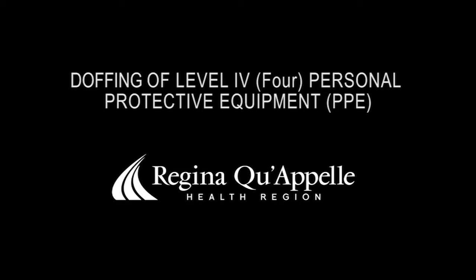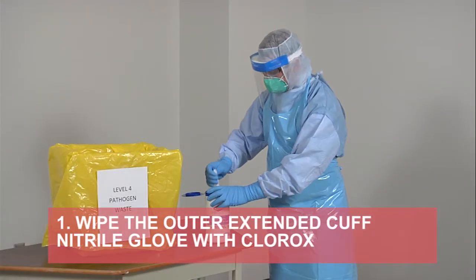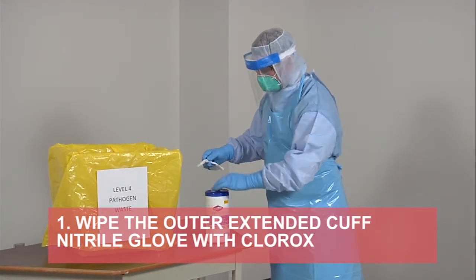The purpose of this video is to demonstrate the proper way of doffing Level 4 PPE. Steps for doffing Level 4 PPE begin in the patient's room.